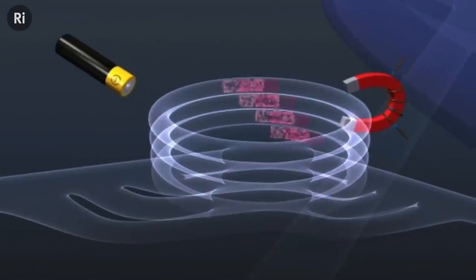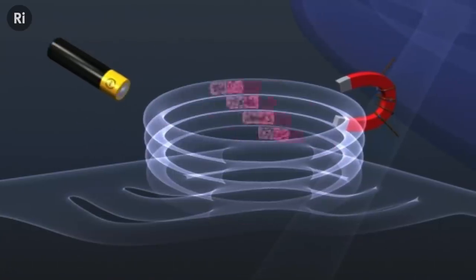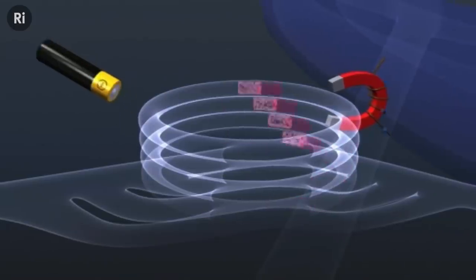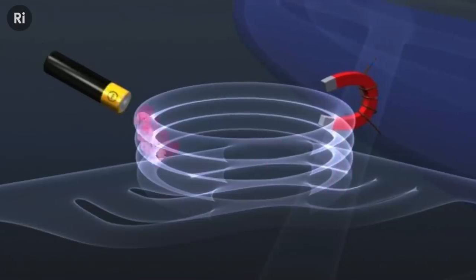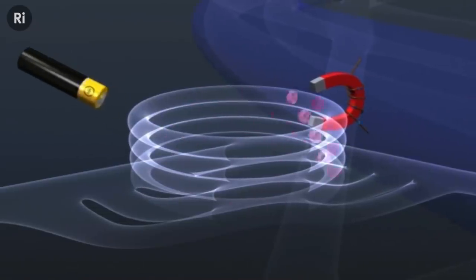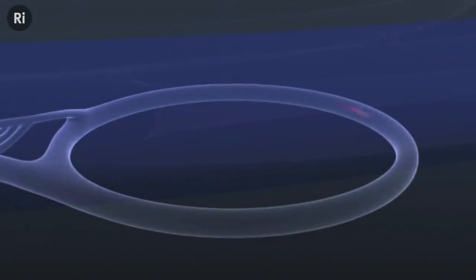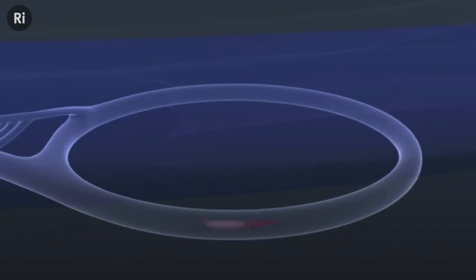Magnets exert a force on the passing protons at right angles to their direction of motion, and so powerful electromagnets are used to bend the beam of protons round the circle. The booster accelerates the protons up to 91.6% of the speed of light and squeezes them closer together. Recombining the packet from the four rings, it's then flung on into the proton synchrotron, by analogy, stage three of our rocket. Let's just follow two such proton packets.